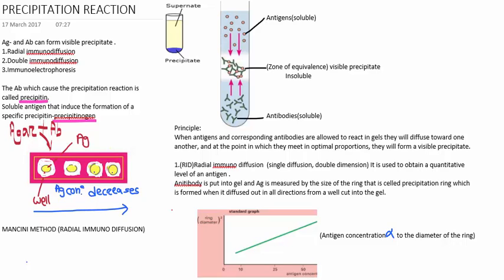We have been talking about the immunology lectures and today's topic is precipitation reactions. So in school days we all have learned that precipitation means when you add some solid material to a solution. Suppose we take a test tube and then add a solution, then add a solid material to it. Then after some time you get the result, that is the precipitation occurs. That means a solid insoluble mass is settled down in the lower part of the test tube. So that is called the precipitate and the reaction is called the precipitation. So this is the normal definition of a precipitation for a layman.